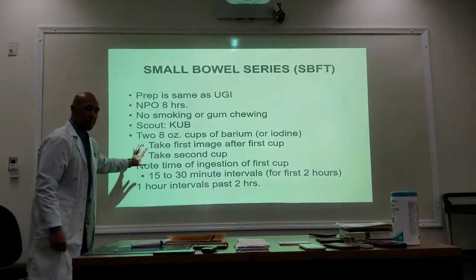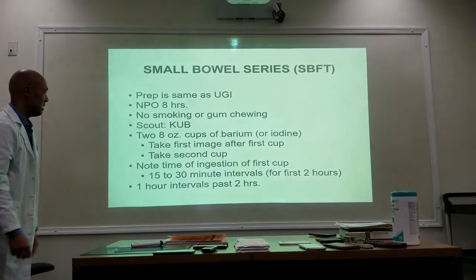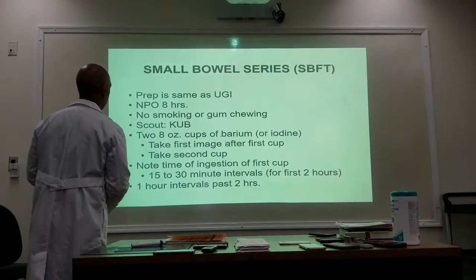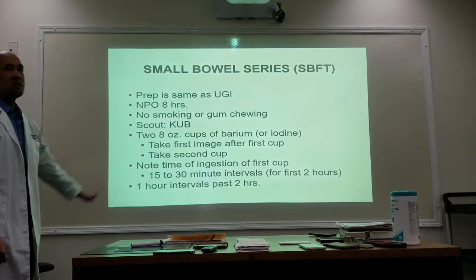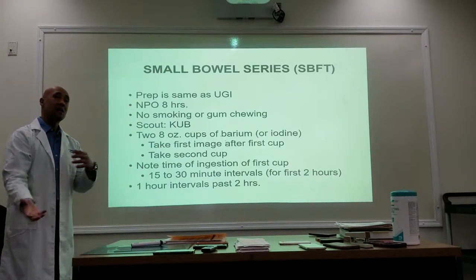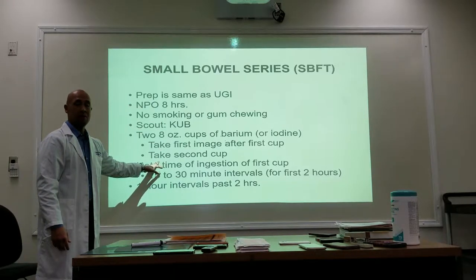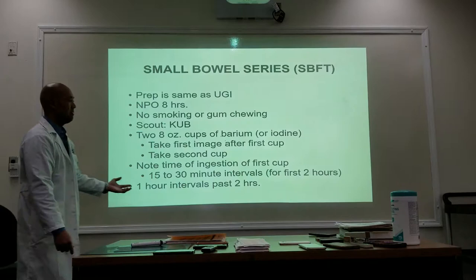All right, so they drink the barium, okay? Make note of the time they start drinking it, and then you take your PA KUB, okay? So you take your first image after the first cup. Then you're gonna set them up and have them start working on the second cup, okay? And depending on what your protocol is in the hospital, you're either going to take your 15-minute shot or wait a little bit longer and take your 30-minute shot for your second KUB, okay? And then again, you take your third KUB and you keep taking those KUBs until it reaches what?